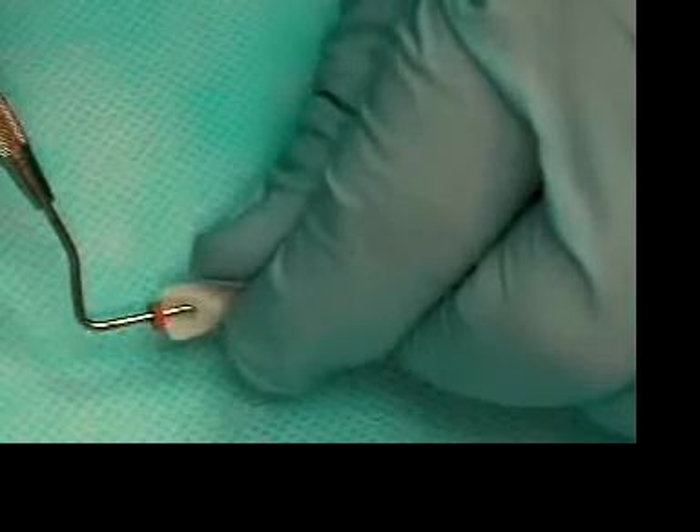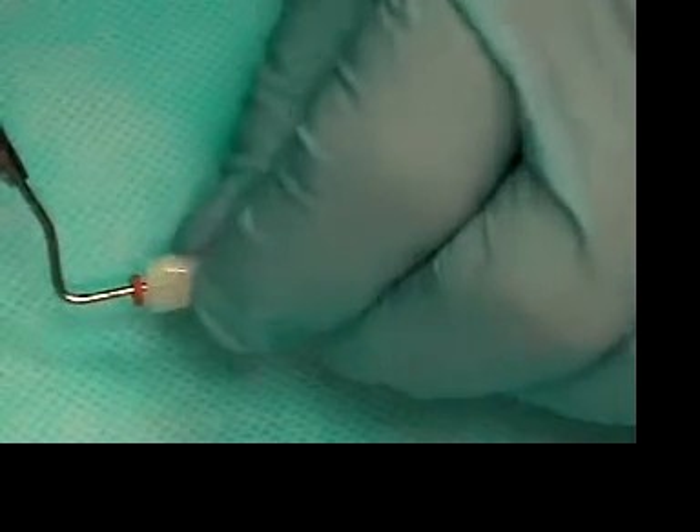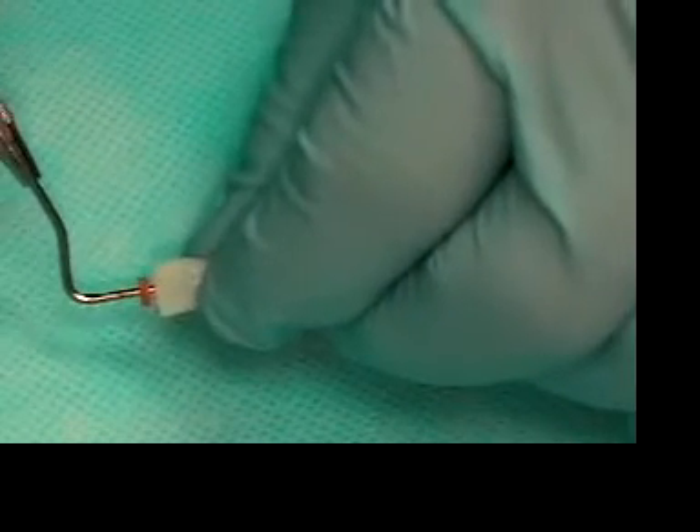We put the plugger into the canals. We see that at 12 millimeters it's already binding — I feel it binding in the tooth, and it's not actually going down to 12 millimeters.